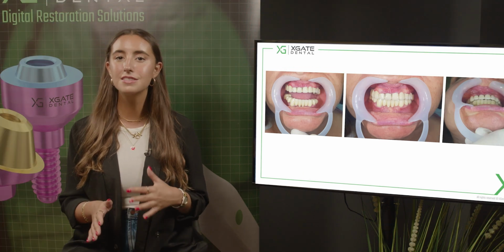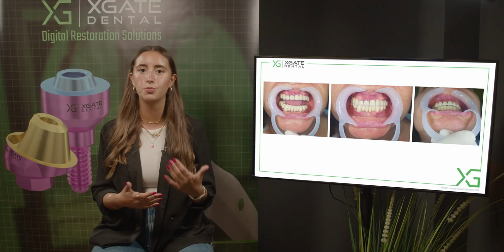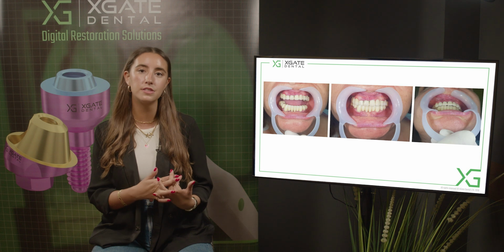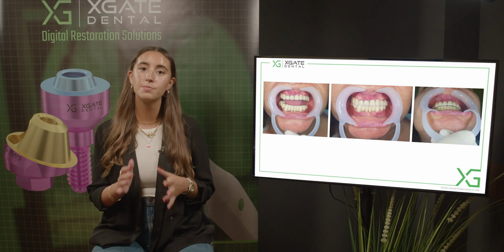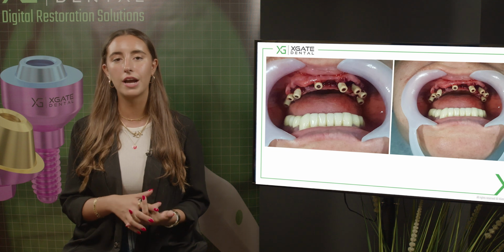The relations is not something that we want to change. She also got used to those relations. She had these bridges for a long time and wanted to stay with them. We just need to extract the teeth and change the bridges to new bridges, in the same relations. So this way, it's much simpler for the doctor to do it one bridge at a time and not everything all at once.